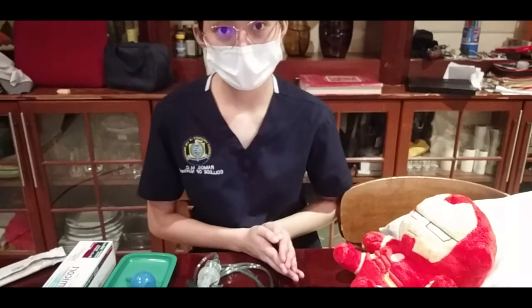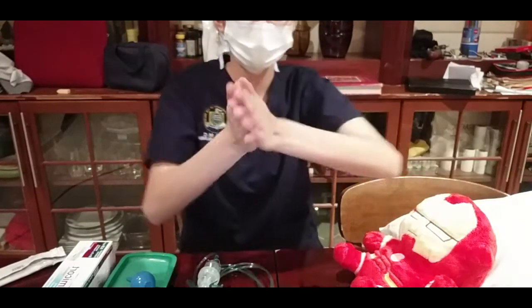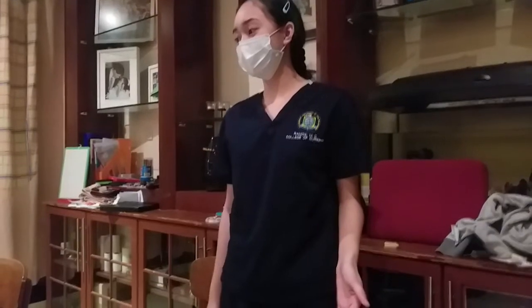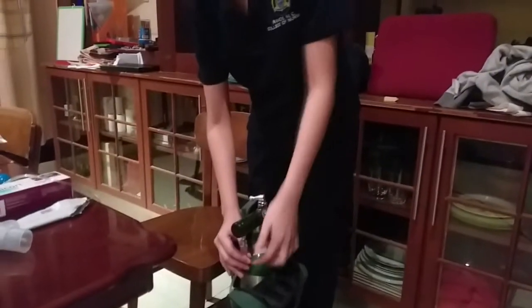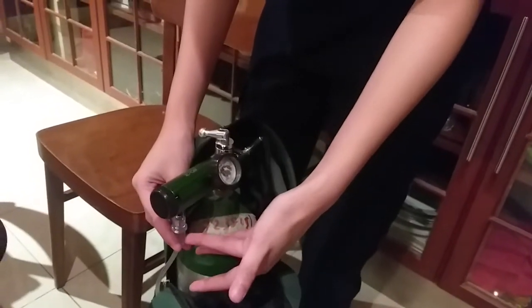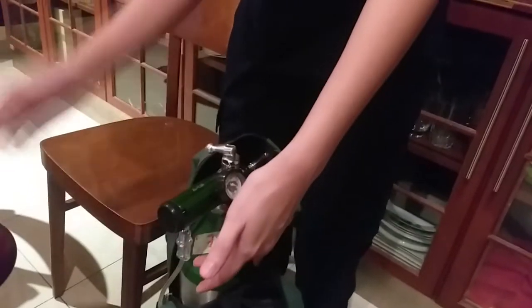And next, for the implementation, I will be performing hand hygiene to help reduce transmission of microorganisms. We will be attaching the oxygen delivery device. So I will be attaching the oxygen delivery device, which I already did. Since our equipment is incomplete, let's just attach it here. In the meantime, assuming that it is already attached, and to the oxygen tubing, and attach it to the humidified oxygen source.